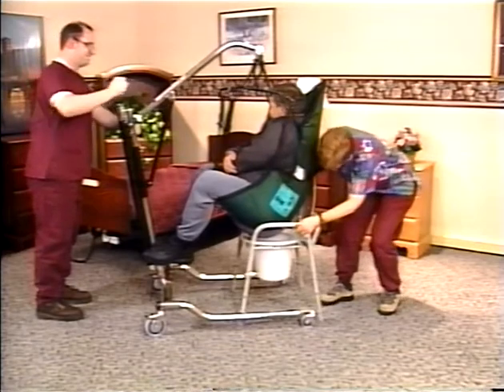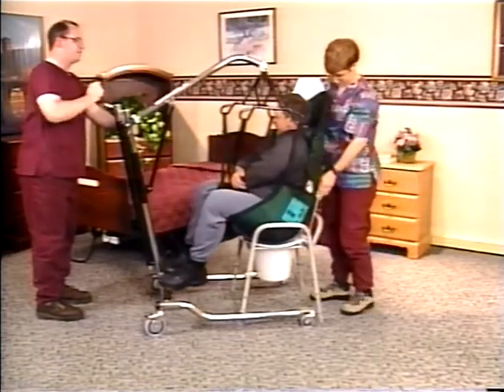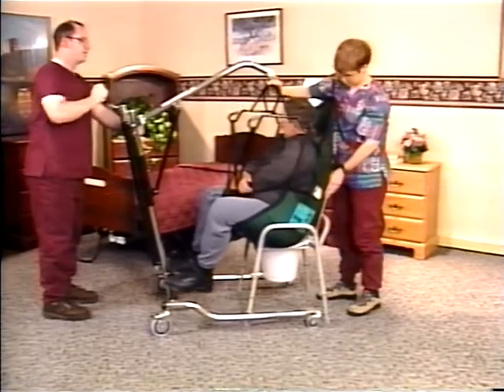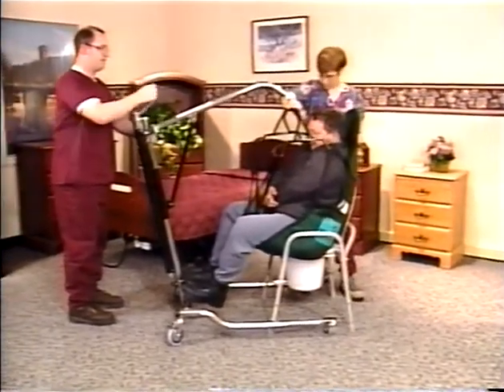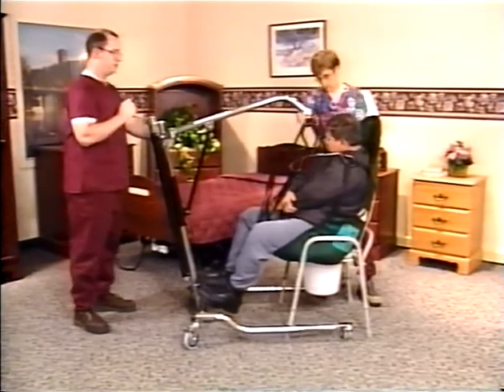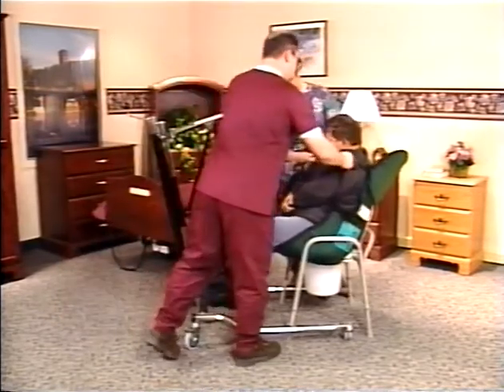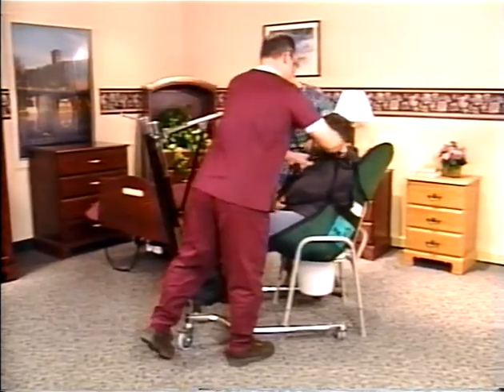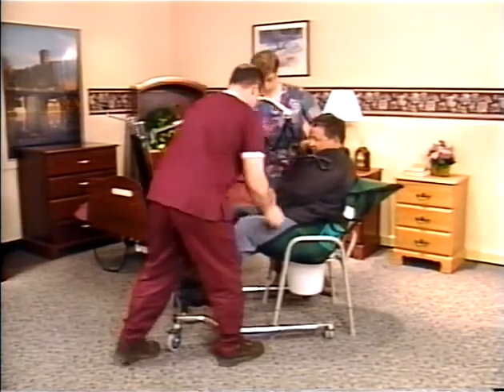Hoyer lifters are designed to provide easy access to most bathroom facilities or bedside commodes. Using the steering handles, just position the lifter around the commode. Carefully lower the resident onto the commode until there's no weight on the support loops. Unhook the loops from the cradle and pull them out of the way. If possible, leave the sling in place.